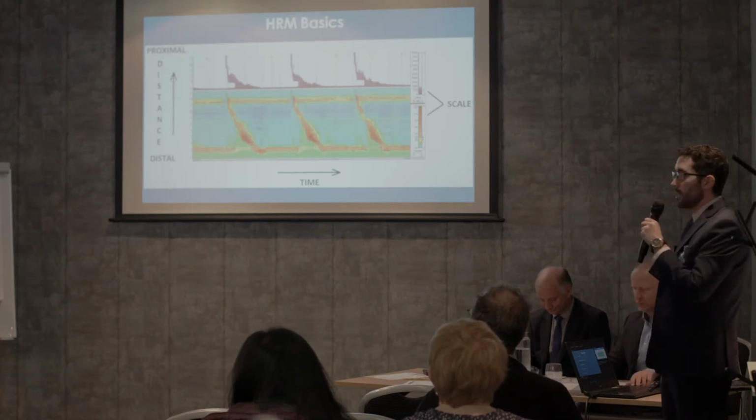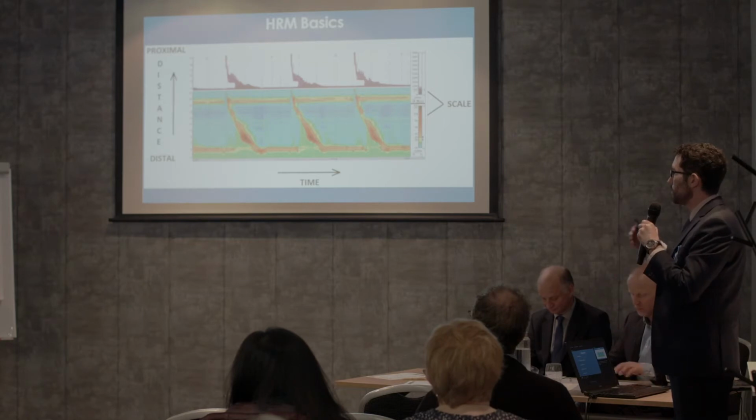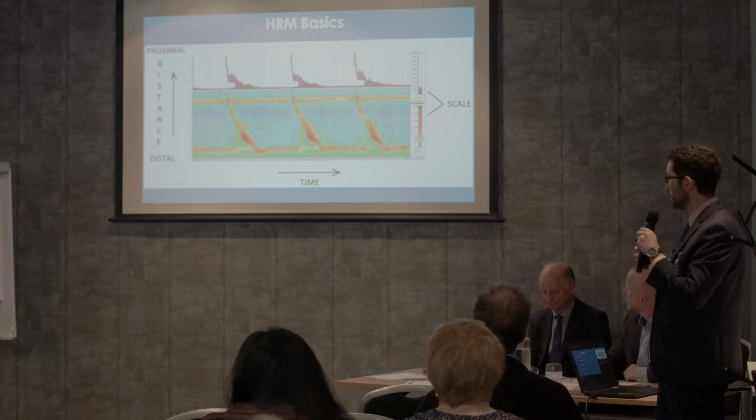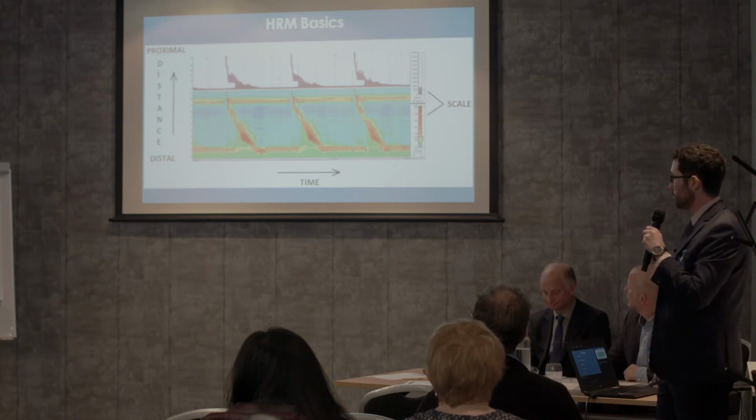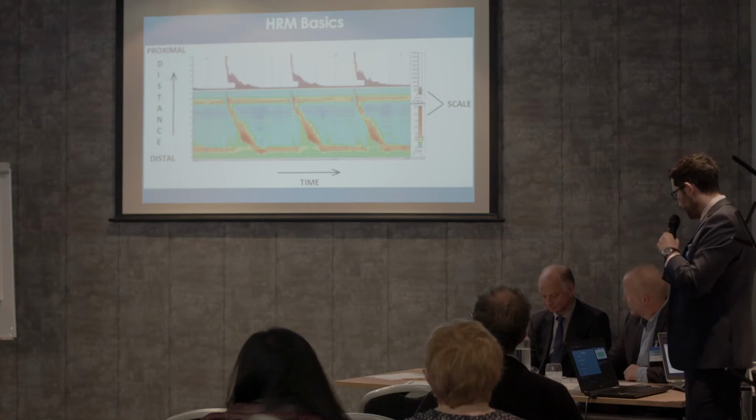So this is esophageal manometry. You're getting this topographical colour plot from the entire length of the esophagus, simultaneous data at 1 centimetre resolution. And the high pressure regions there in red and the low pressure regions in blue.